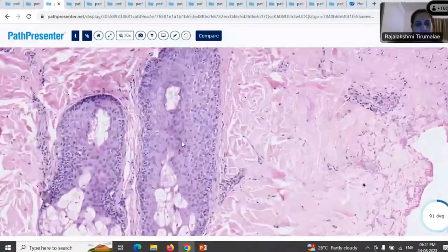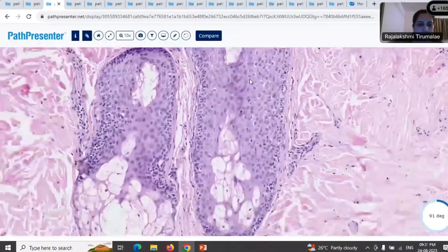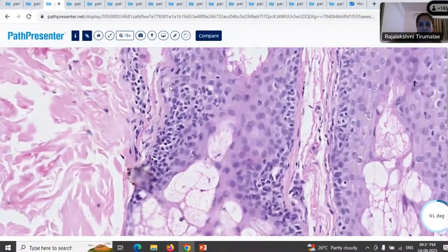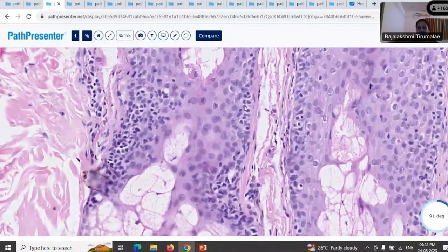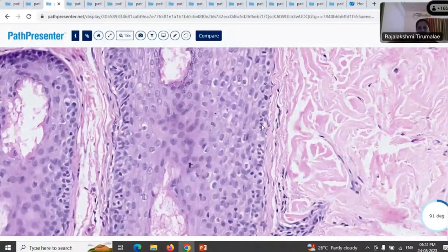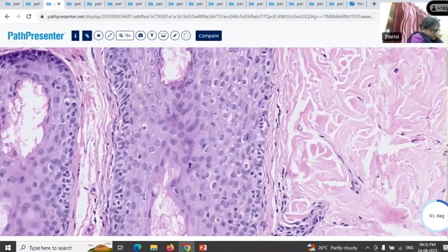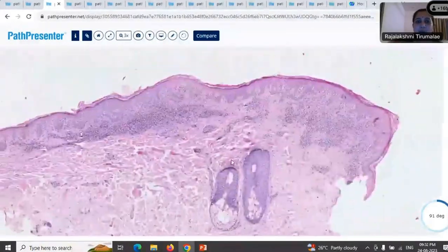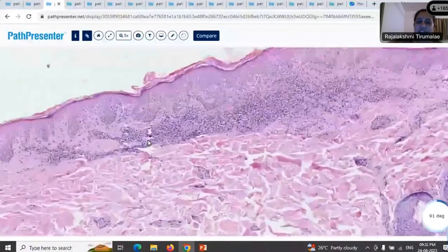Can we look a little bit at the hair follicle here? Yes, do you notice anything here? Do you notice that these lymphocytes are also peppering the hair follicle? Yes, ma'am. The same thing, the basilar epidermotropism, there is also folliculotropism here. You see that? Yes. And there is no basal vacuolar alteration. There's nothing else. It's as if the epidermis is absolutely not bothered by these cells which are coming.